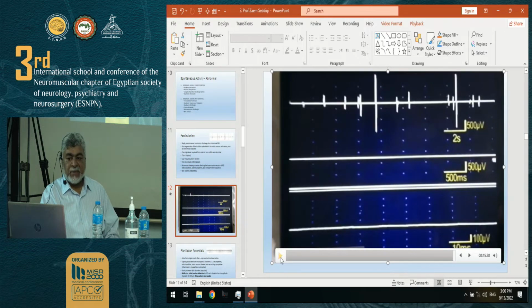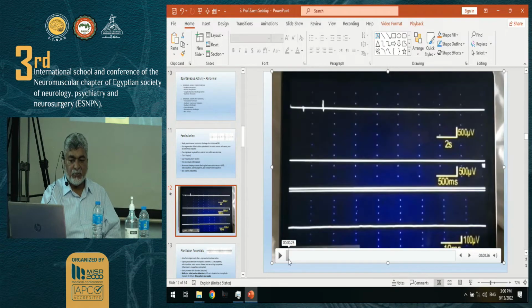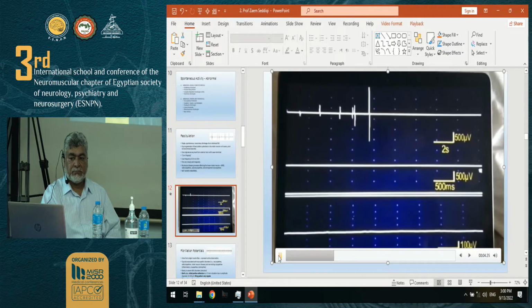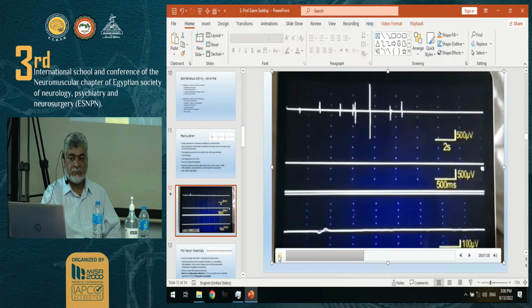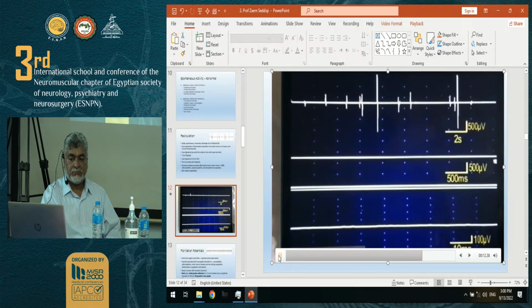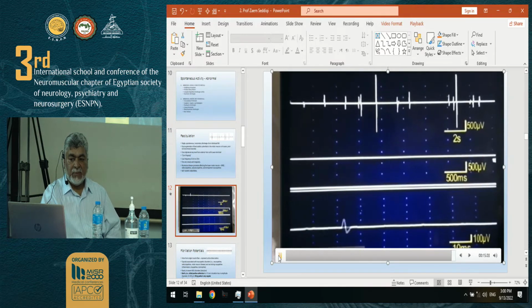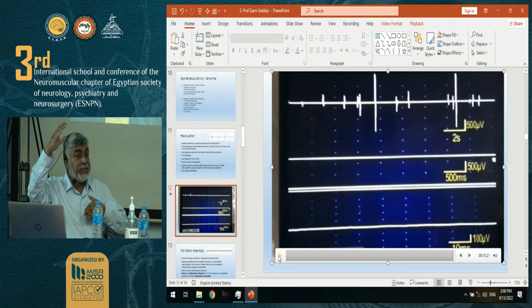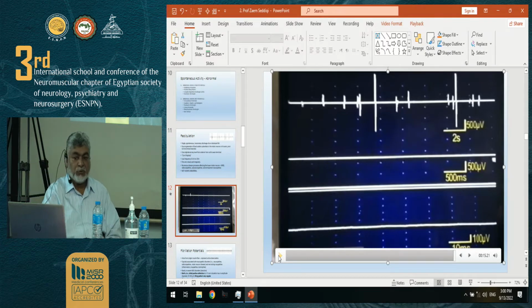Hear that? They look like motor units, okay, but they're not firing like motor units. They're not rhythmic, and they come unexpectedly, suddenly, and then become quiet. They can repeat themselves after, and there are multiple fasciculations in this. Okay, one more time, just for you. So they come from different motor units of different size and shape, sometimes reinnervated motor units, so they may be very large. Fasciculations can be very large if there is reinnervation. So just like in neuropathy, they can range from very large to small, okay?